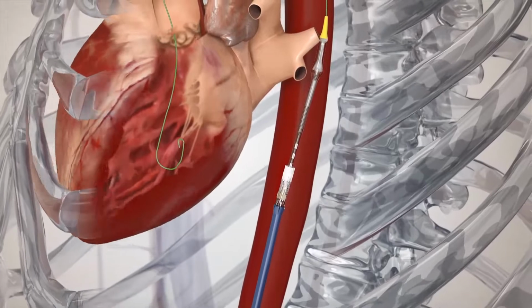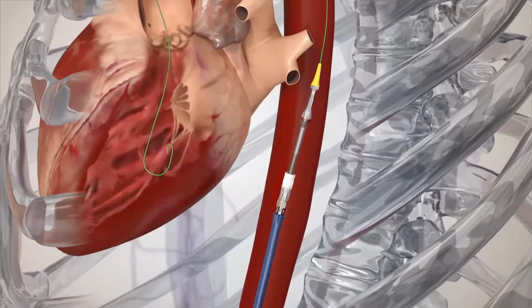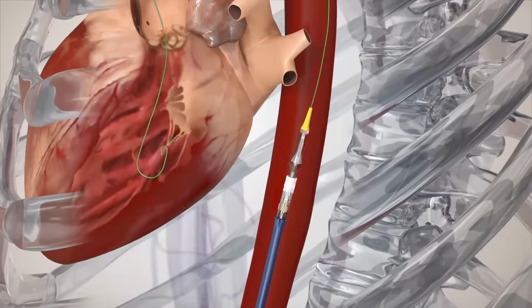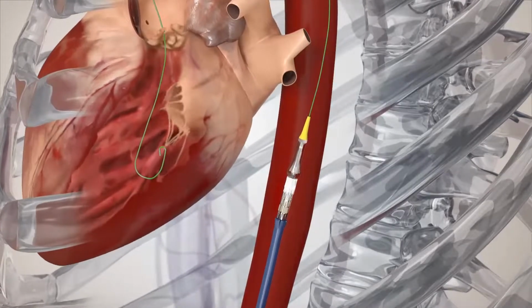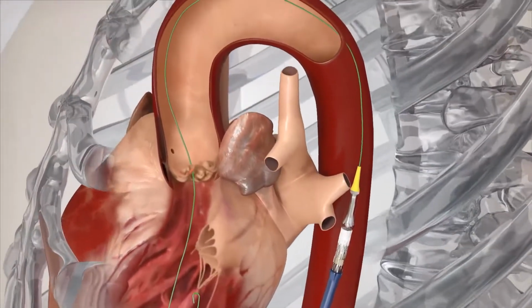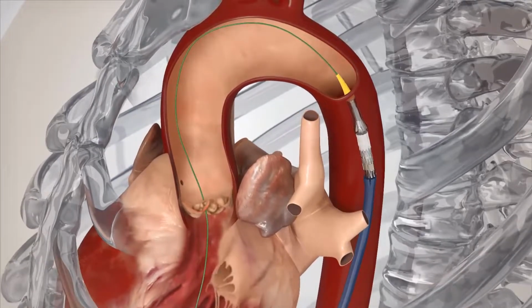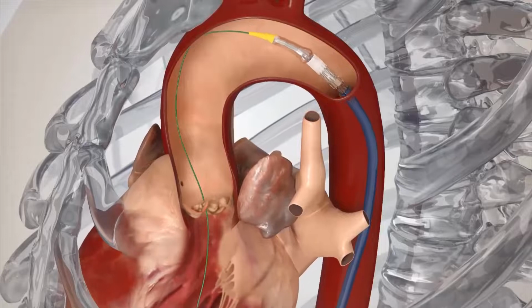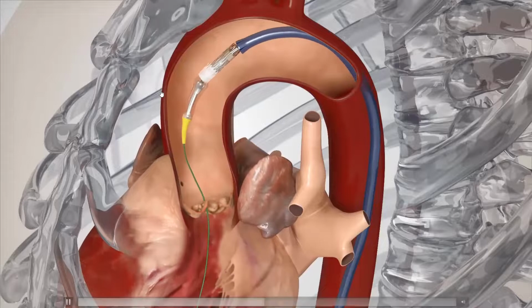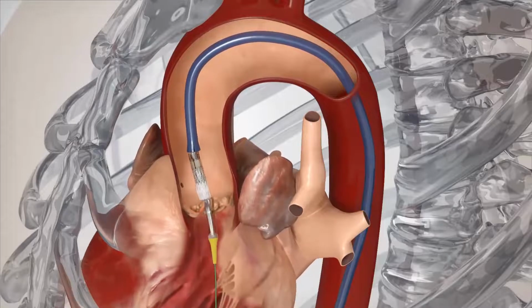What we know is that every time you're manipulating the valve, whether it's wiring, ballooning, et cetera, you're increasing the risk of stroke and getting in more trouble. So what we do is we go in with this valve, then you pull the balloon onto the valve, and this way you're able to lower the profile so that you can put the valve system in patients with smaller blood vessels. Then you're negotiating this valve around the arch, and you can imagine that there's a risk of stroke associated here. So then you bring it down, articulating the top of this delivery system, and you bring it down into the valve really.